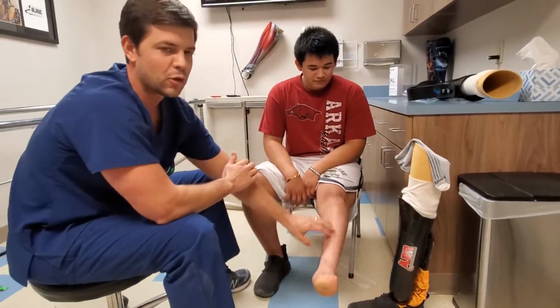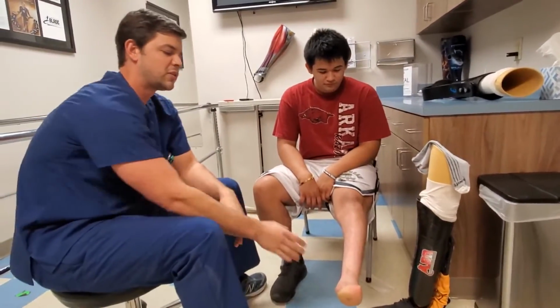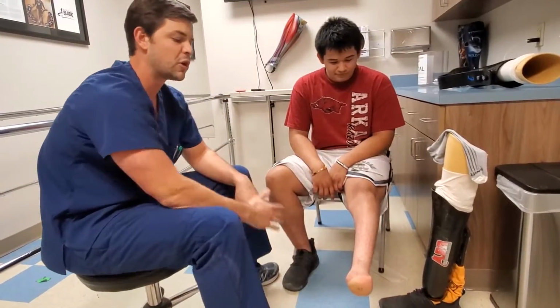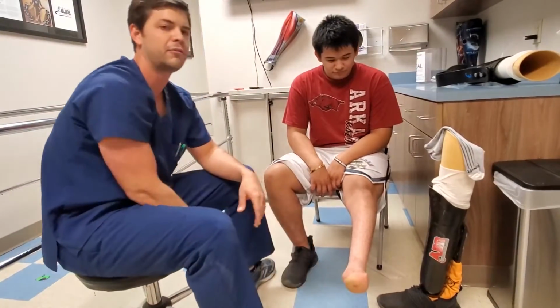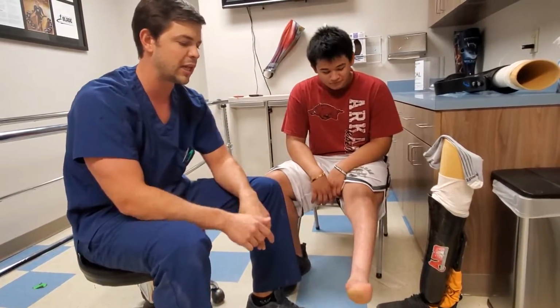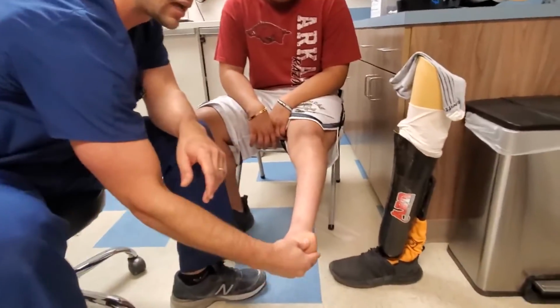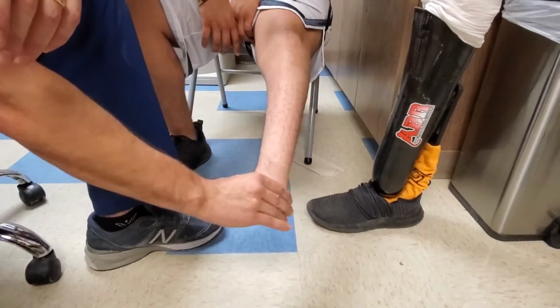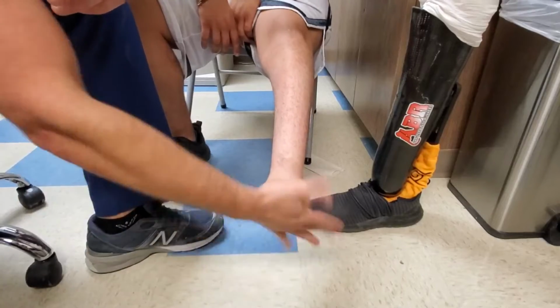I don't have any radiographic images to really determine if this is a true Syme's amputation or a Boyd amputation. What we do know is he has a heel pad down here. He can fully distal end bear on his leg. What I like about his amputation is his heel pad has not slipped, or it's not as mobile as we've seen in the past. So his heel pad is preserved down here that he can actually utilize this.